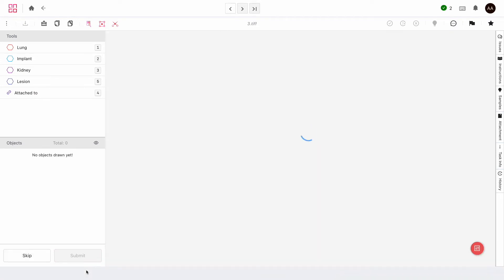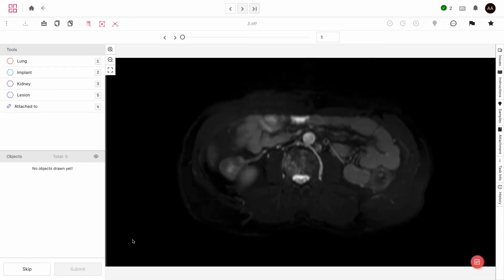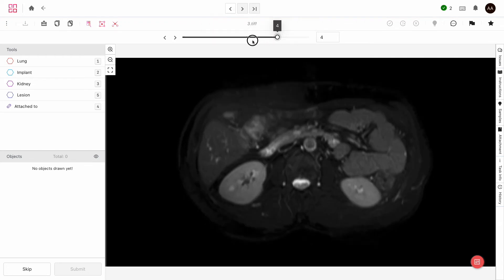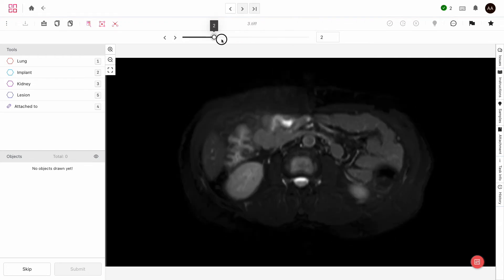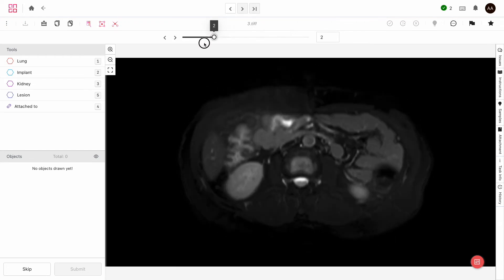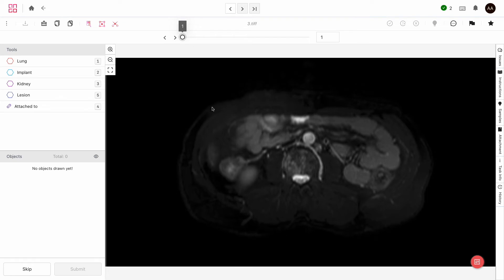So this is a multi-page TIFF file and it's perfect for CT scans. By using the slider here at the top, you can scrub through pages really quickly. Let's say we want to label the kidney here. I'll do it manually just to show you what that looks like. But you can use all the AI assistance tools here too. By holding shift as you draw, Englehub will place points for you without you having to click.